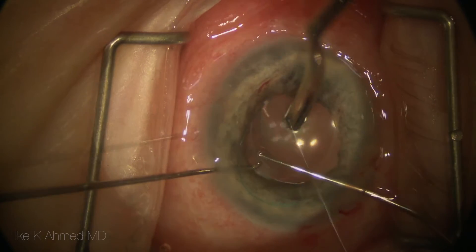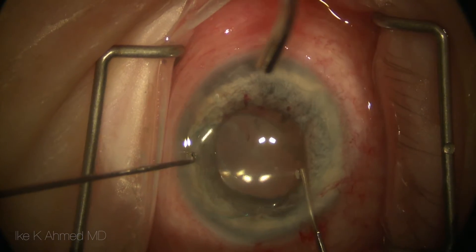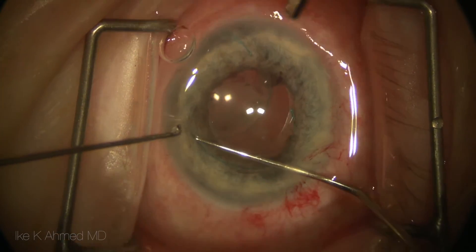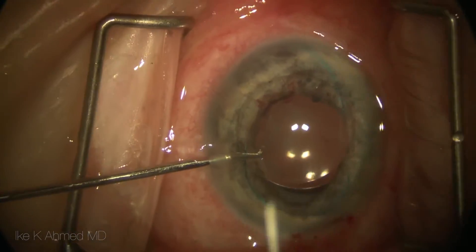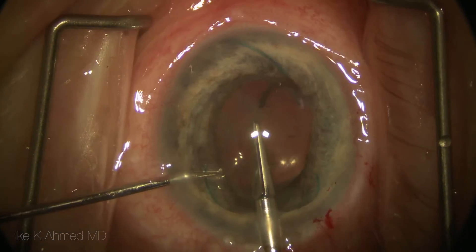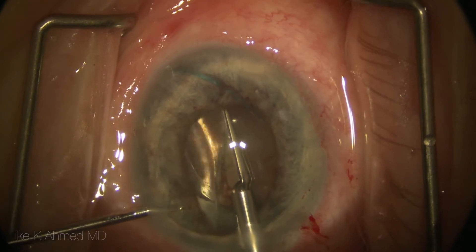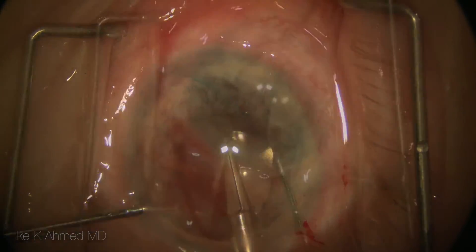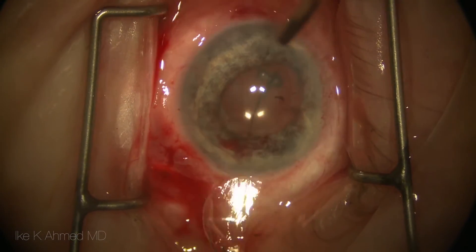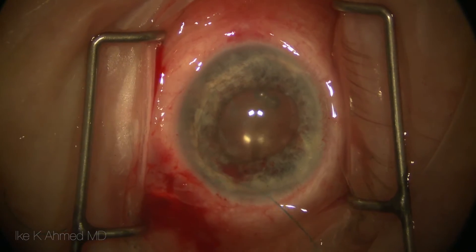The sulcus IOL is fairly easily extracted from the sulcus and rotated into the anterior chamber. The sulcus lens in this case was a three-piece acrylic lens, and this will be cut using a bimanual technique with a pair of intraocular cutting scissors while holding the optic with a pair of micrograspers to fixate the lens in the anterior chamber. Both cut halves are then removed from the anterior chamber after the cut has been made.